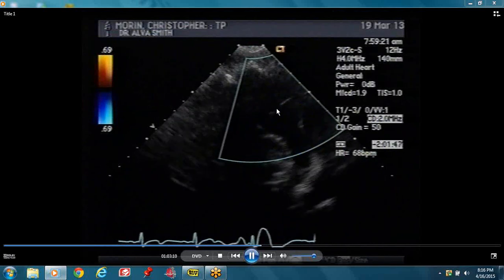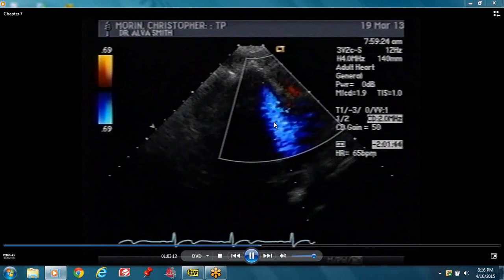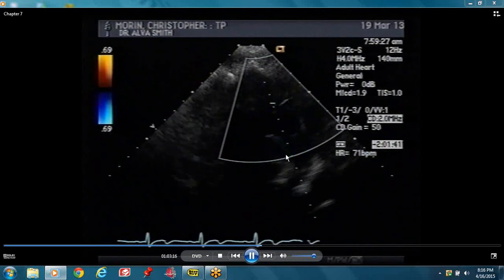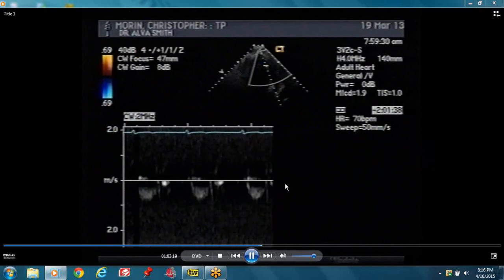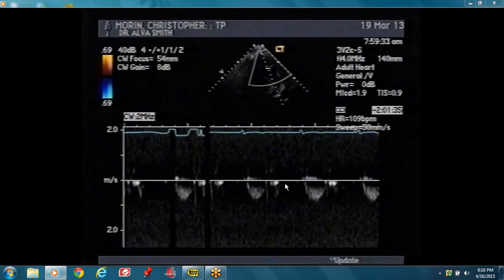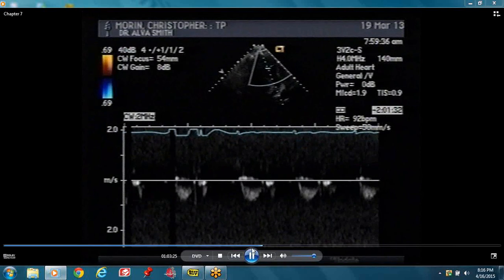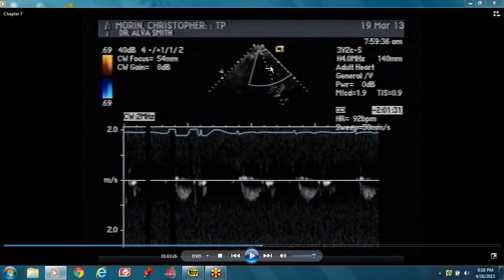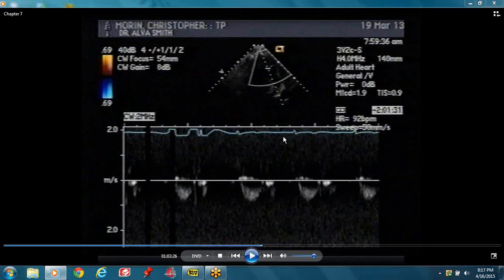The pulmonary valve is right there — it goes into the pulmonary trunk, which splits into the right pulmonary artery and the left pulmonary artery. The cursor is across the pulmonary valve and you get a Doppler signal below the baseline, gated with ECG, occurring in systole. This is a normal ejection across the pulmonary valve, with blood flowing from the right ventricular outflow track across the pulmonary valve into the pulmonary trunk.